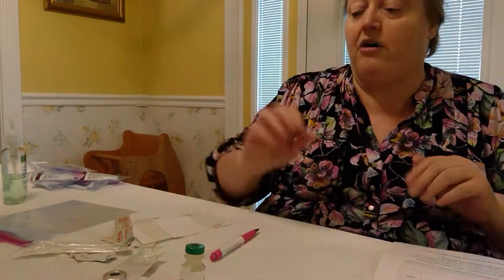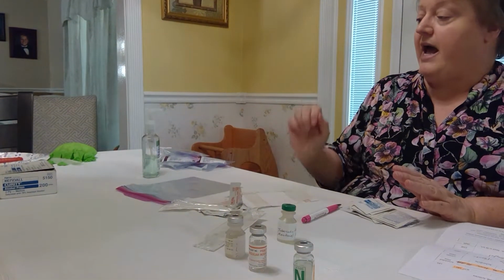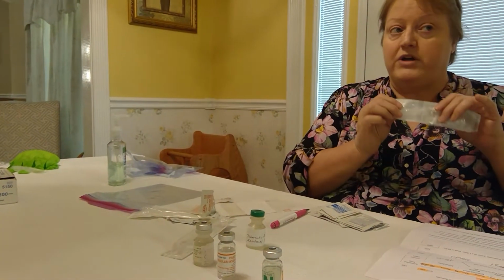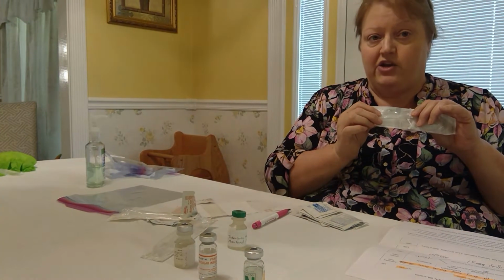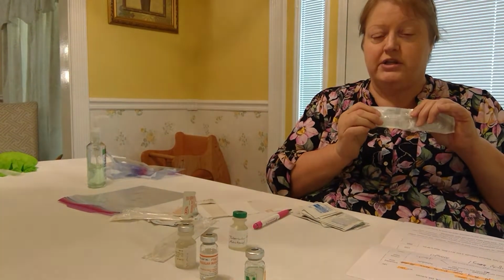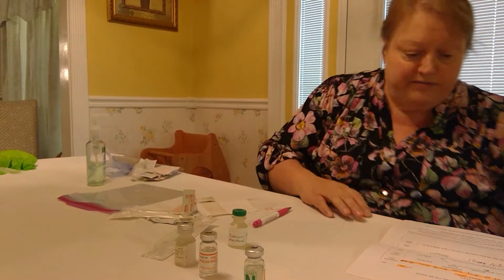You're going to gather all your supplies that you're going to need. I'm going to need Band-Aids. I'm going to need more alcohol. I'm going to need an additional needle because whenever you give anything IM, you always change your needle to a fresh one. I do not know that y'all have an additional needle in your kit to change, but if you do not, you must tell us that you are changing the needle prior to giving it IM. Okay, I'm now ready to move to the patient's room.